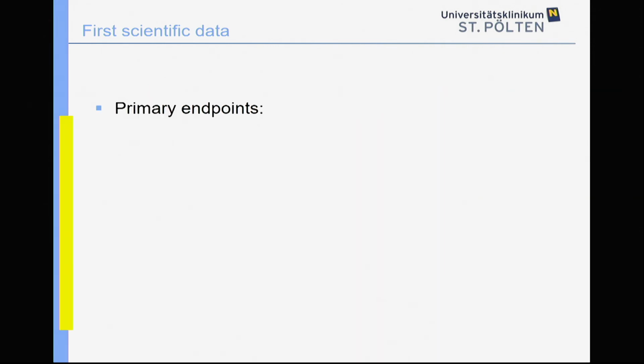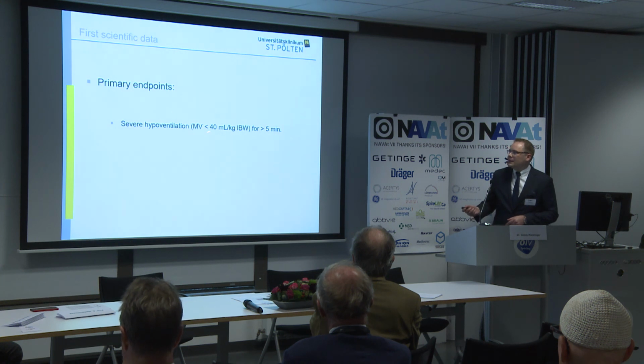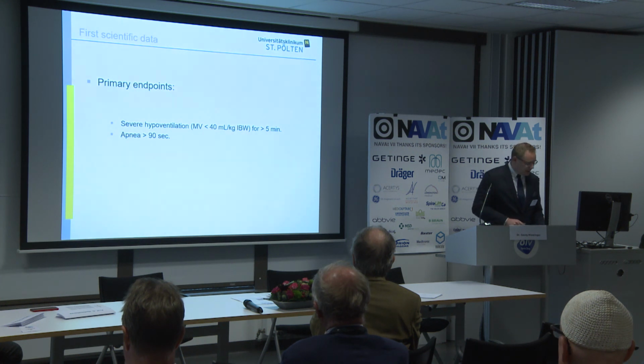Okay, what were our endpoints? It was just a feasibility trial or proof of concept study. We didn't have a control group. We just performed ventilation with smart ventilation control on these 100 patients. And the endpoints were as follows. First one being severe hypoventilation, defined as a minute volume of less than 40 milliliters per kilogram for more than 5 minutes. Second being apnea for more than 90 seconds.